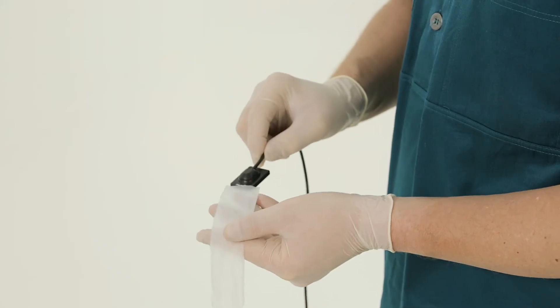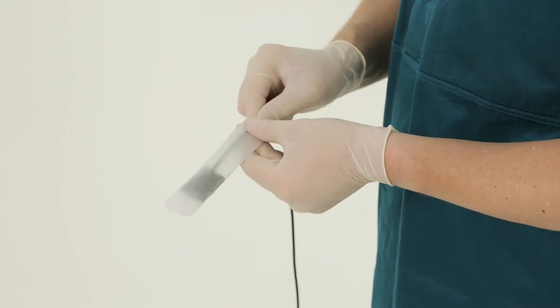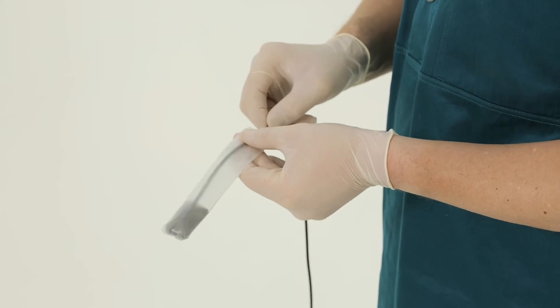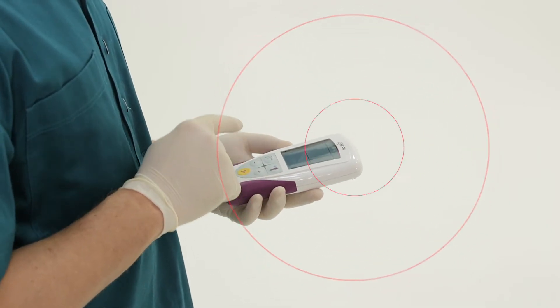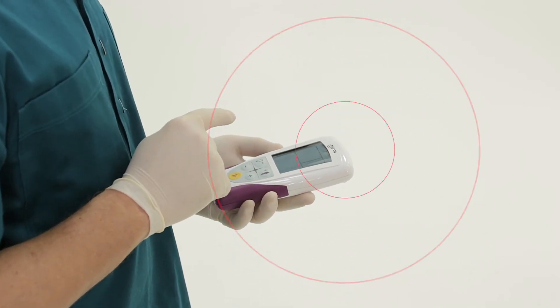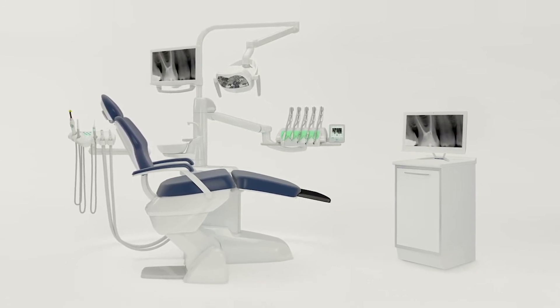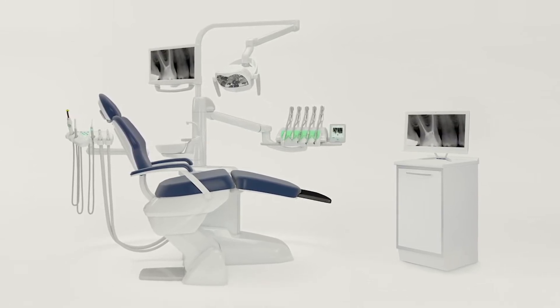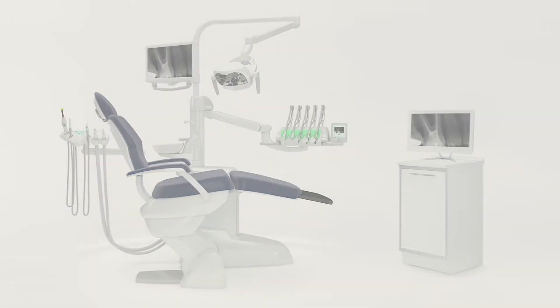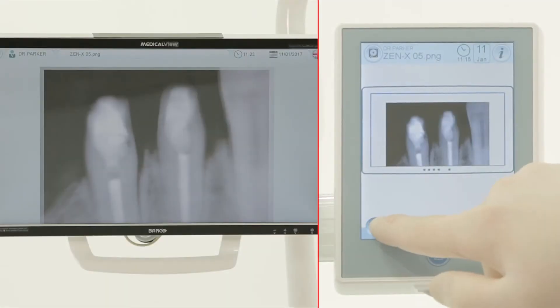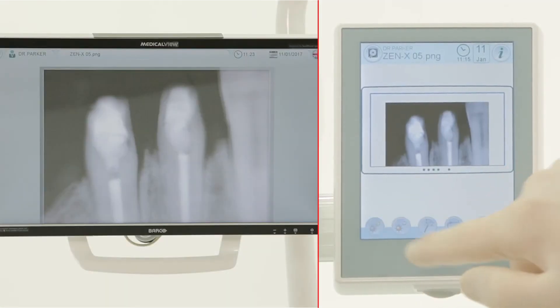Select the sensor to capture the x-ray image. Once captured, the x-ray image is displayed simultaneously on the three devices. Before saving, you can also adjust the image brightness.